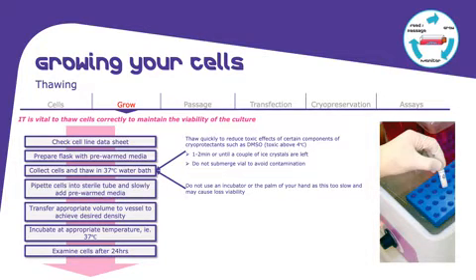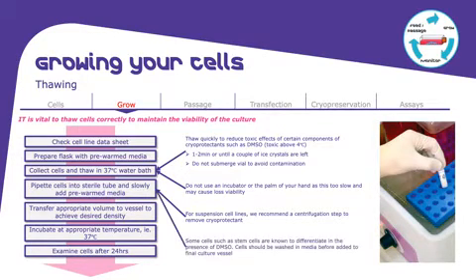Pipette the cells into a sterile tube and slowly add pre-warmed media. It is a very important step as well. Especially for suspension cells, we recommend using centrifugation afterwards to remove any traces of DMSO or any traces of cryopreservation medium. Also, as I mentioned, if you're working with stem cells, this is a very important step for you, because DMSO can cause differentiation of the stem cells. So do it fast. Do not spin at very high speeds. You remember, you spin it only at 150 G.